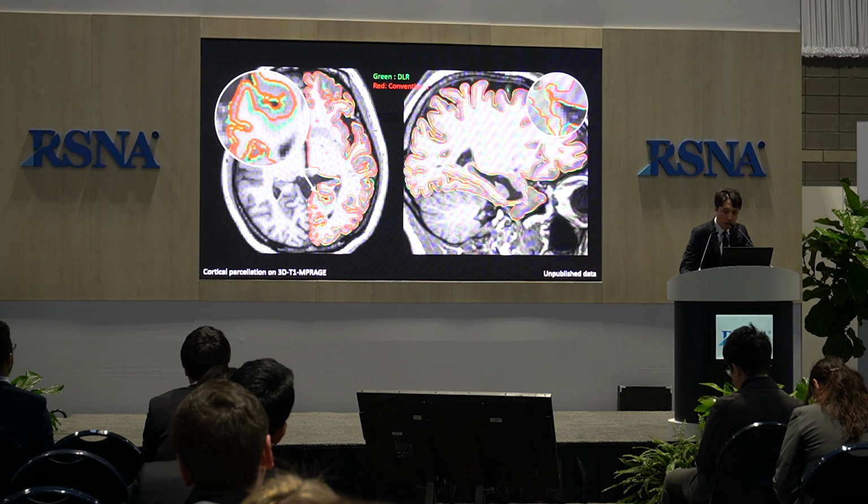Radiologists may not realize how the MR image quality evolves over time because we are so used to it. These brain MRIs taken in 2023 seem quite usual, nothing fancy or outstanding. However, if we look back at the MRI of the same patient taken in 2008, the radiologists will appreciate how much MR image quality has evolved.